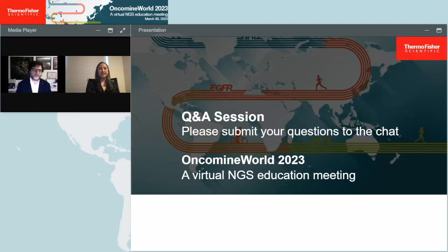Certainly, that's a great question. The two platforms are quite similar, but do have differences. But from a reporting and endpoint perspective, as it pertains not only to HRD but other biomarkers as well, we do expect the two platforms to give very concordant results. I had a small figure on the very last slide to show that they are highly concordant. That is because the underlying algorithm is identical between the two platforms.